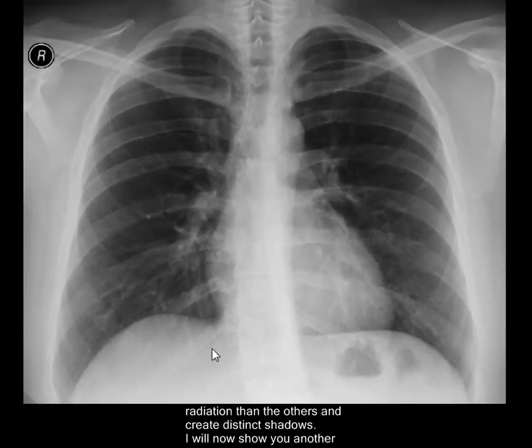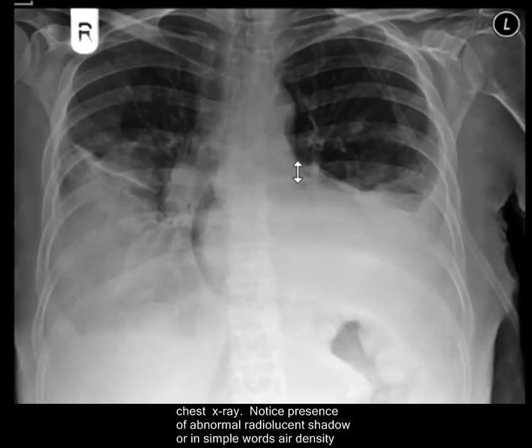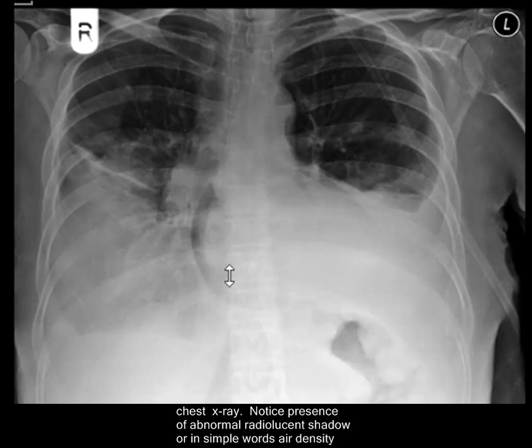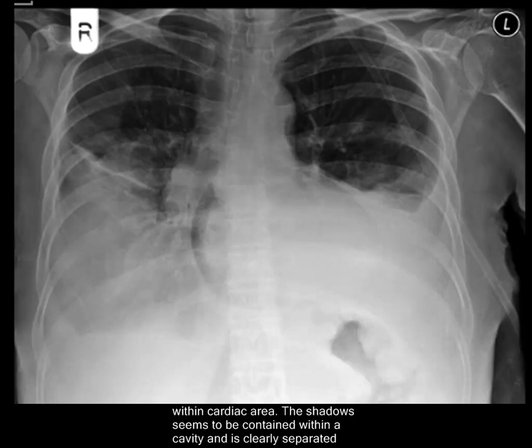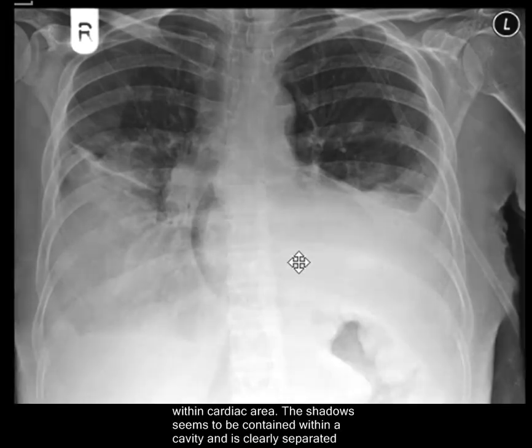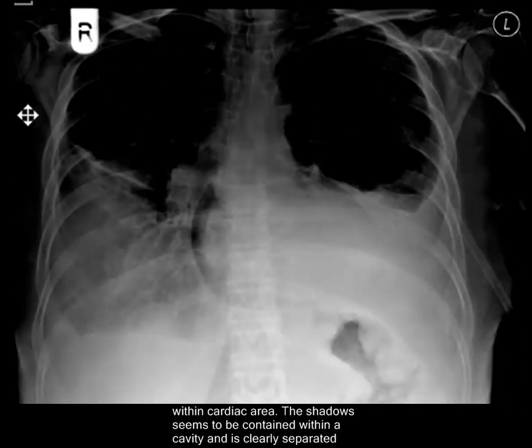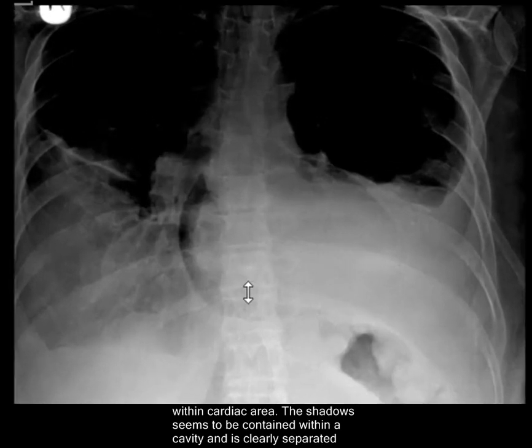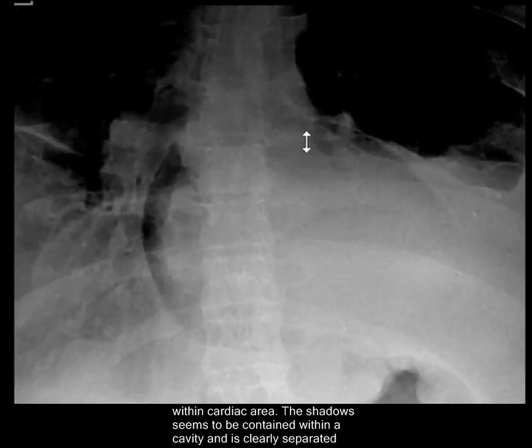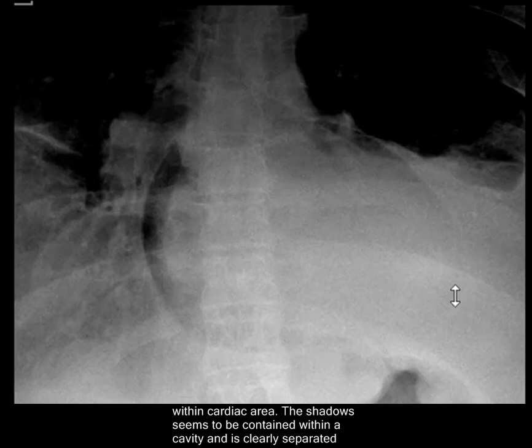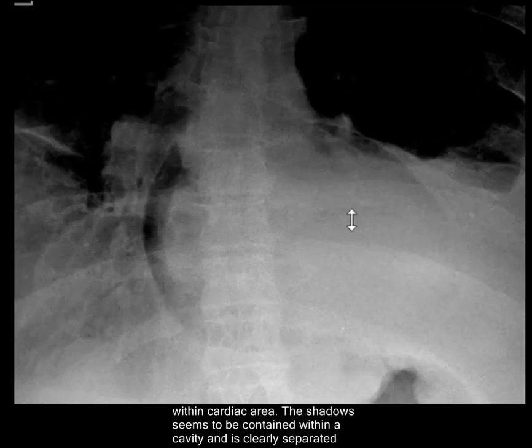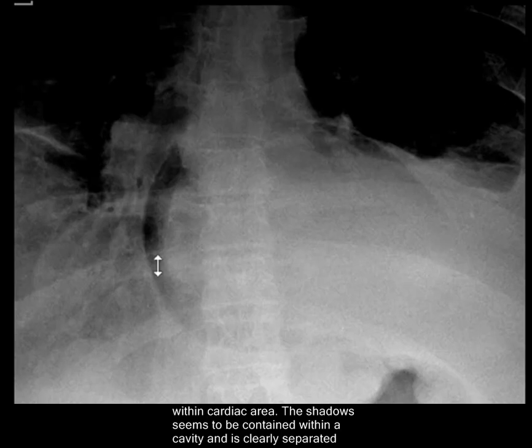I'll now show you another chest X-ray. Pay attention to the cardiac area once again. Notice the presence of a radiolucent shadow, or in simple words, air density within the cardiac area. Let me change the window level settings and zoom in so you can clearly see the air density — a conical shadow of air density within the cardiac area.